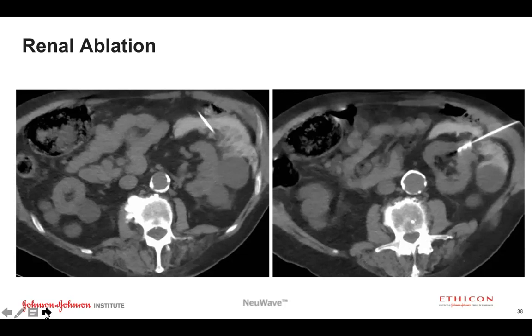And sometimes you have no choice because you're limited by your anatomic constraints. But if you can avoid going directly into facing the collecting system, it's optimal to do that. It's better to come tangential. And one of the reasons is that the microwave tends to desiccate the tissue. And during that desiccation, you get shrinkage of the structures around there and a pulling in of the adjacent structures. And you certainly see that in the liver, and we didn't really focus on it during the segment on liver ablations, but if you pay attention while you're doing liver ablations, you'll actually see a desiccation of the nearby structures.